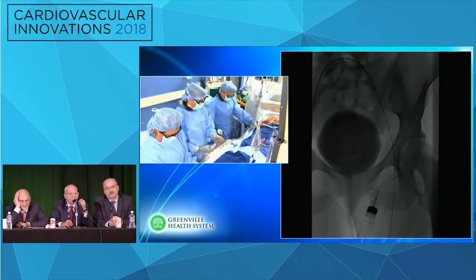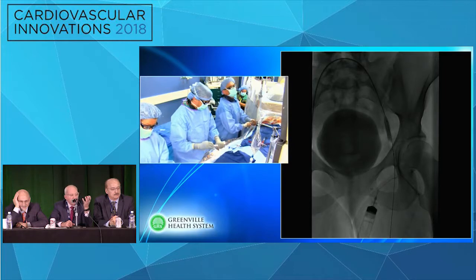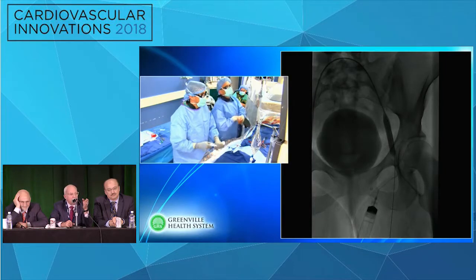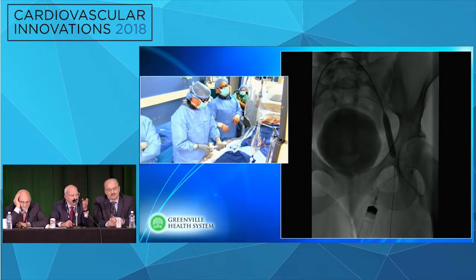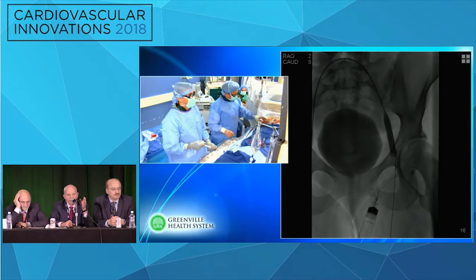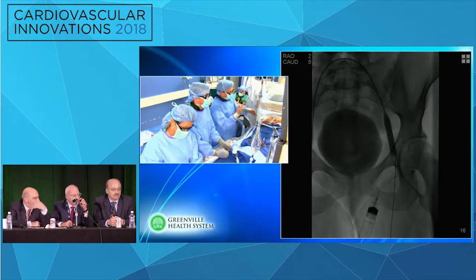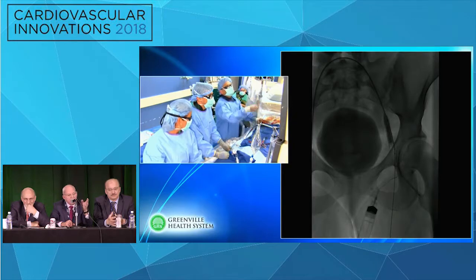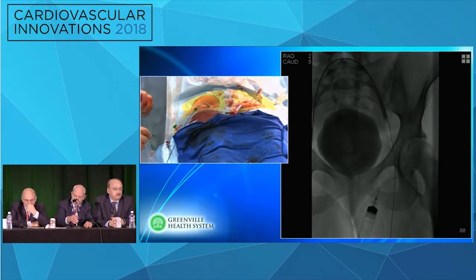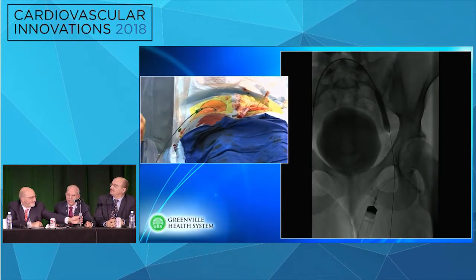So, I mean, we certainly put it up to the level of the IVC or a portion up there, but I try and avoid, and often at the IVC the confluence is wide enough that you can place it there, effectively deal with your stenosis, and not completely jail off the contralateral iliac vein, because then it becomes a real problem if you ever have to get access again. So I'm reluctant to just willy-nilly put it up high enough in the IVC to essentially jail that off, but I think you do have to go into the IVC for a few centimeters. But again, the confluence is usually wide enough that it'll stay there, and you still have room to get by on the iliac vein on the other side. That is what we have done in a few cases, is to not completely jail it, but actually have it flowered in, if the right side is perfectly normal.